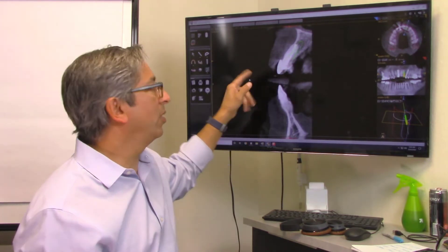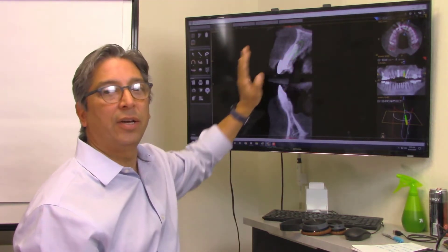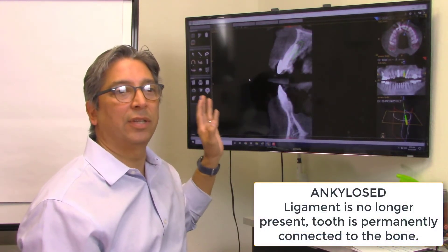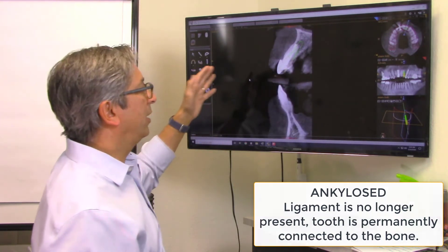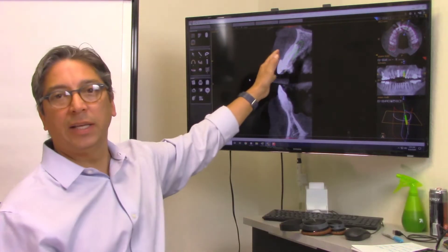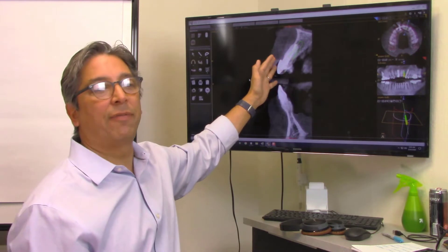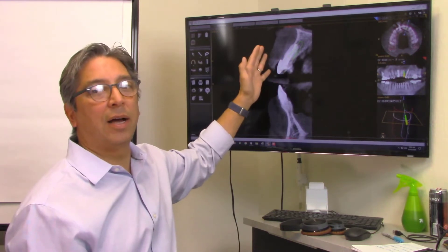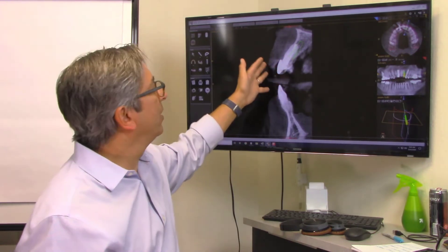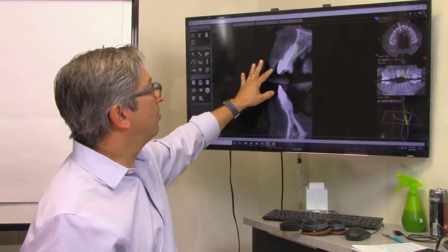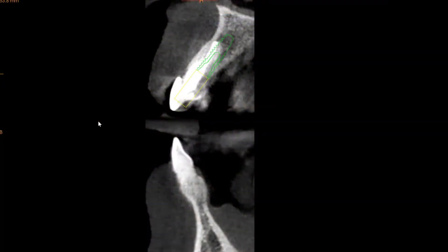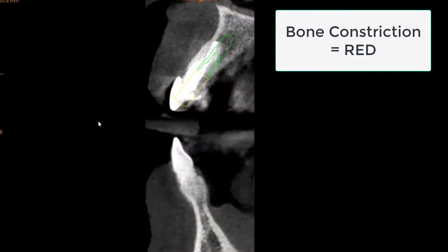With a root canal treated tooth you have to think that it may be ankylosed, and this is an older gentleman. Luckily this came out fairly easily, didn't take a lot of effort, and the facial plate is intact.